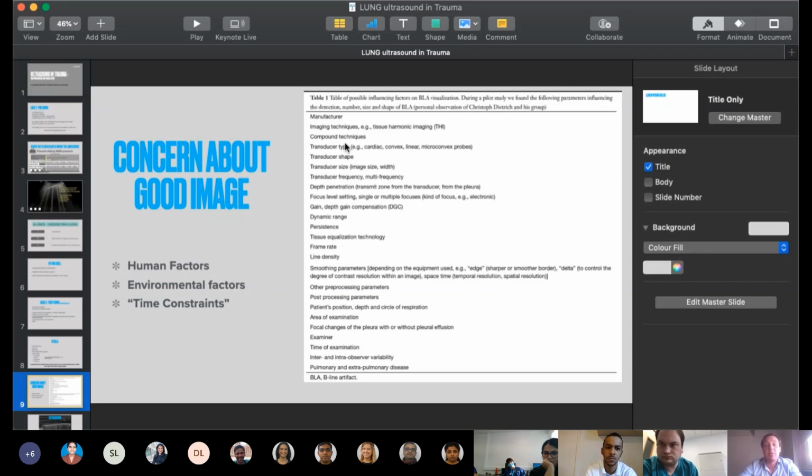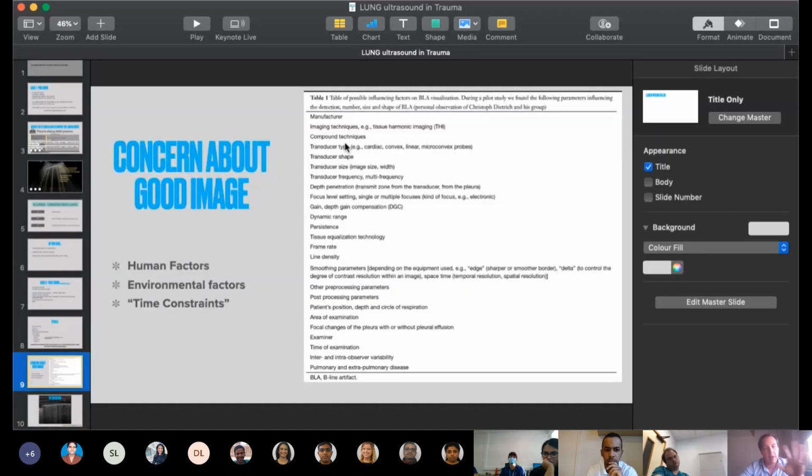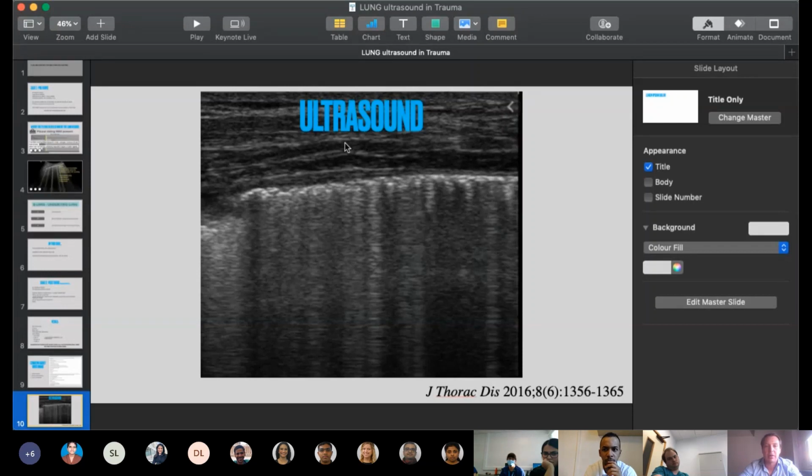Now, in this case, people were pushing for a patient whose SATs can't go up above 90 with 100% oxygen, high PEEP, high pressures. And they said, well, it's all from a pneumothorax, or we have to manage a possible pneumothorax. Again, in this case, we used lung ultrasound on both sides. She had good pleural sliding, and luckily Yasir did amazing images in a talk on that. Then we found all these B lines along her pleura on both sides. The decision in the end was not to do finger thoracostomies and not to do ICDs, and we transported her to CT, accepting that we were struggling to ventilate her, but we didn't put unnecessary pipes in her.